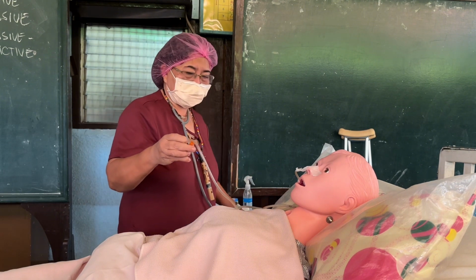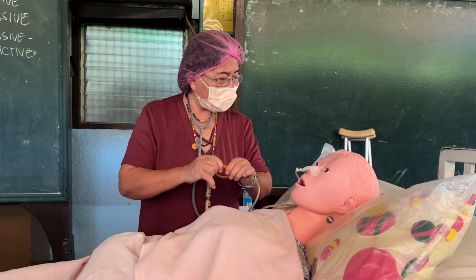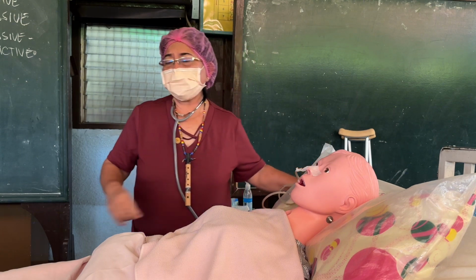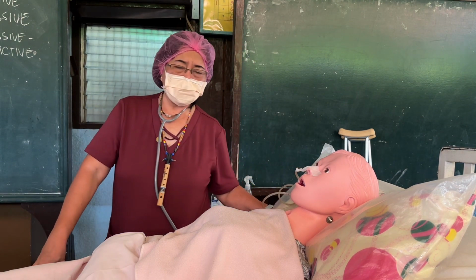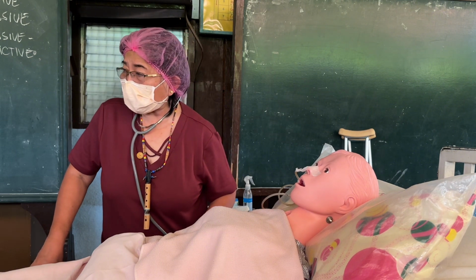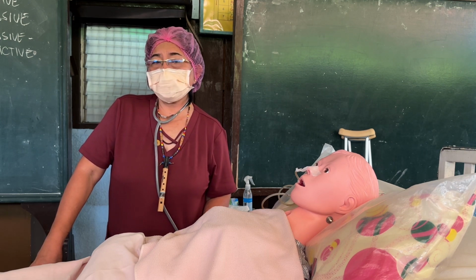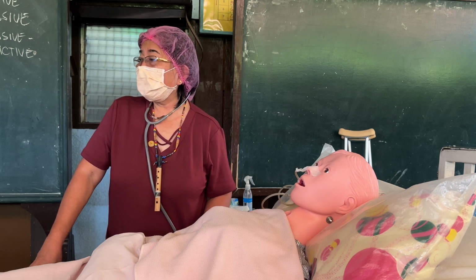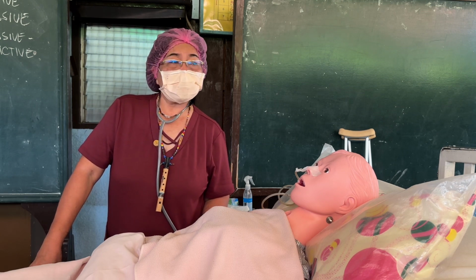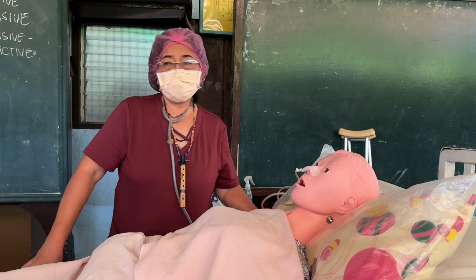Okay, you're done. Now, documentation. Date, time, who gave the feeding. If you had an assistant, write the assistant's name, and then the feeding, how much, what you fed, the medications, how many flushings you did. Then the reaction of the patient. Also, you mentioned that you check and confirm the tube first. Okay, let's proceed.